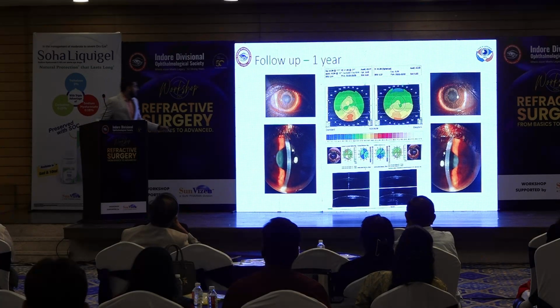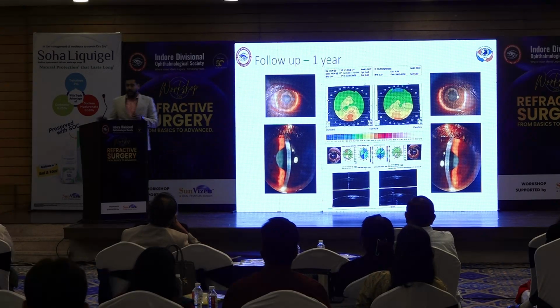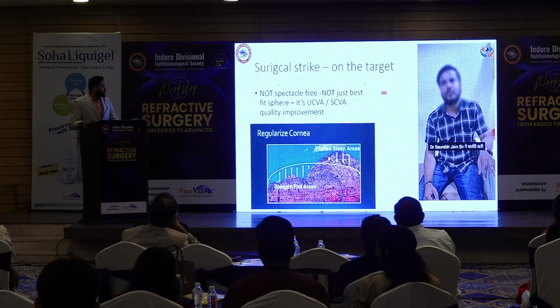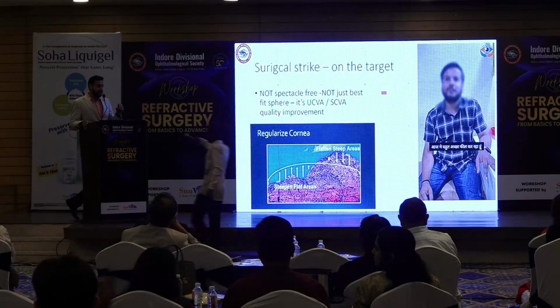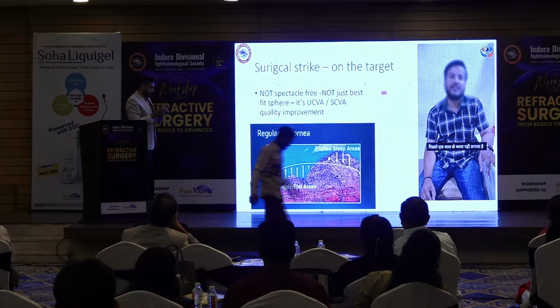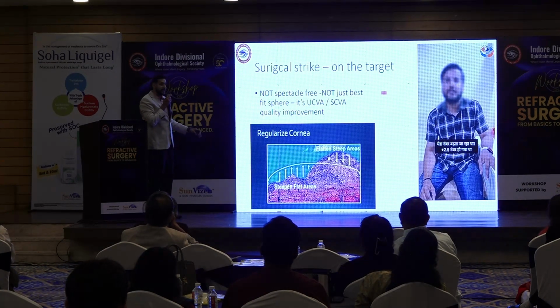Here, if we can concentrate, the ablation profile exactly had a haze, and this haze actually helped us in flattening of the cornea. My point today is that for a surgical strike, we have to be flattening the steeper areas and elevating the flat areas.